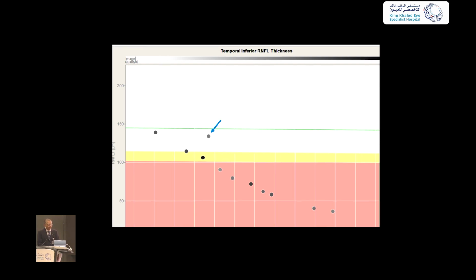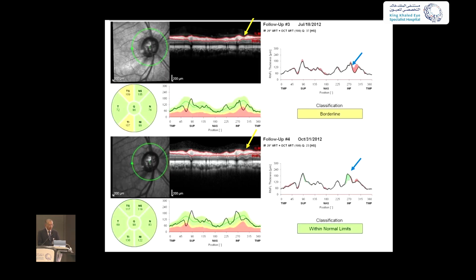The anomaly is this. How did the patient regrow their nerve fiber layer? How did the nerve fiber layer become thick again? Yeah, you can see it. It's real. You can see the nerve fiber layer became thicker. How is that possible? Anybody? You can see actually it grew.